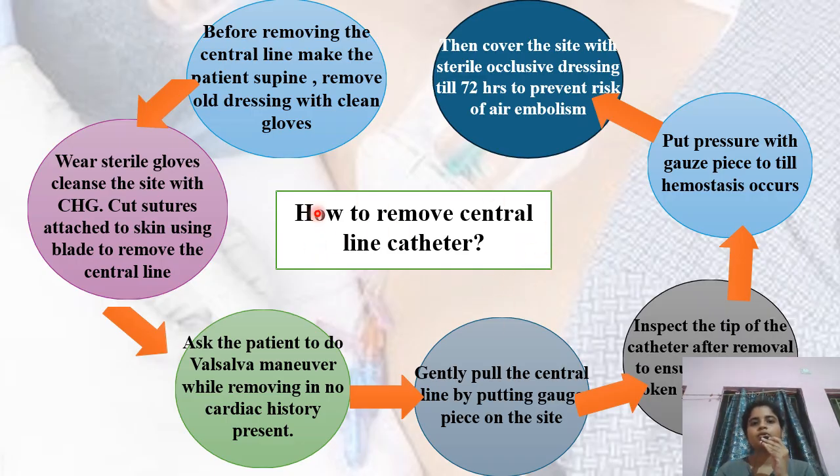Okay, so suppose it is a tunnel catheter or non-tunnel catheter, based upon its use. Sorry, the non-tunnel catheter we can't keep for many days because there are high chances of infection. Whereas the tunnel catheters or implantation ports are present for a longer duration because of hemodialysis or because of the chemotherapeutic agents the patient is on, so they can be kept for many days. But the non-tunnel catheters have to be removed once the patient is out of the ICU.